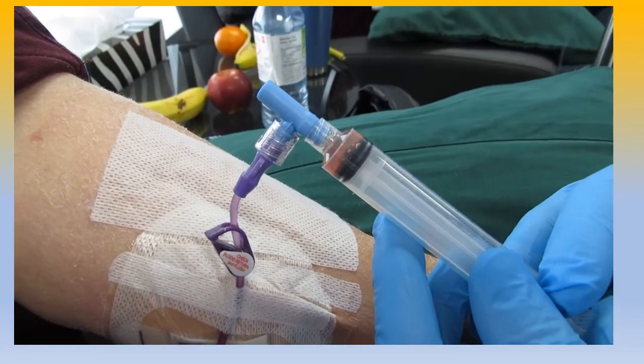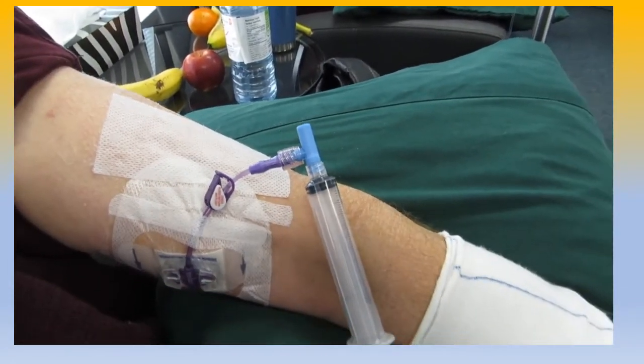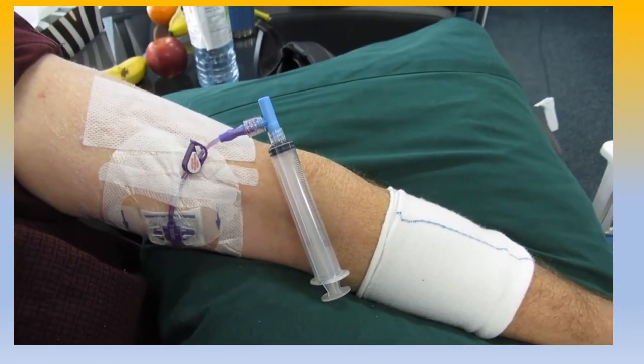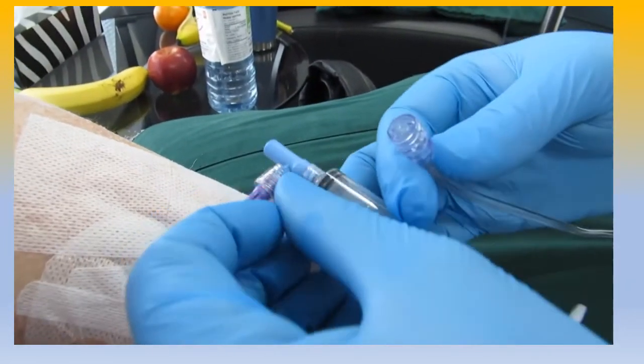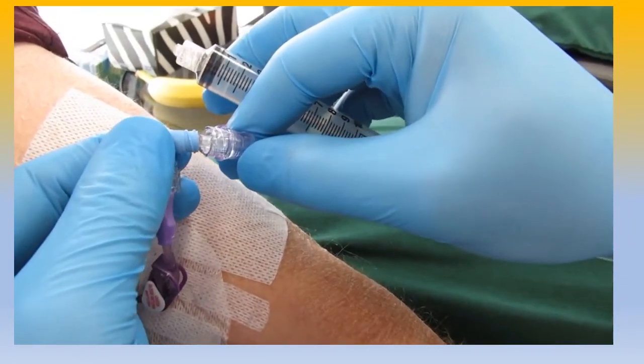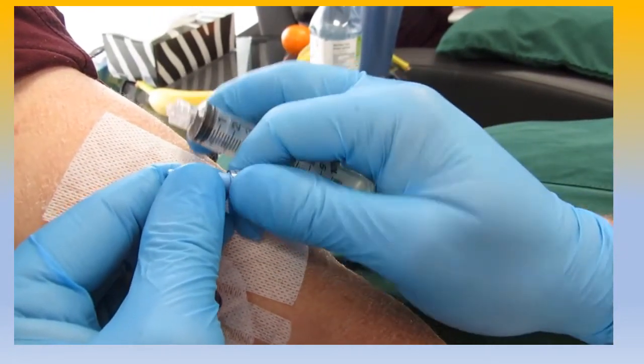And the reason why we're using a 10 ml syringe is because the pounds per square inch is sufficient enough that it won't damage the internal structure of the PICC. If we go with a smaller 5 ml syringe, it can damage the actual internal workings.